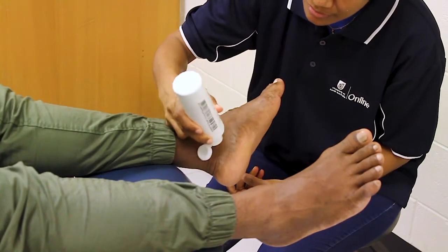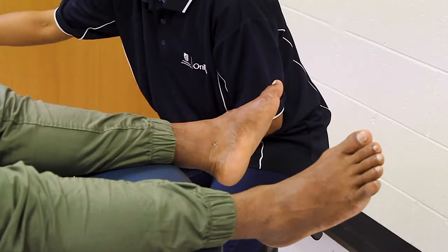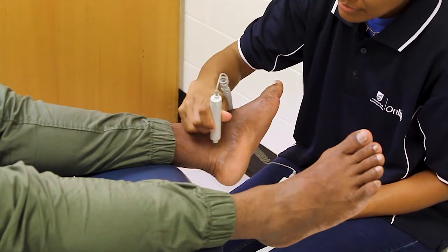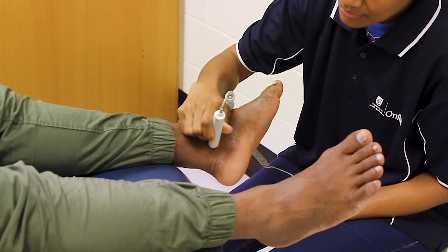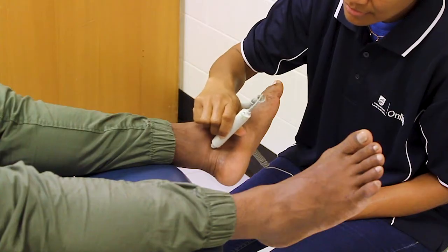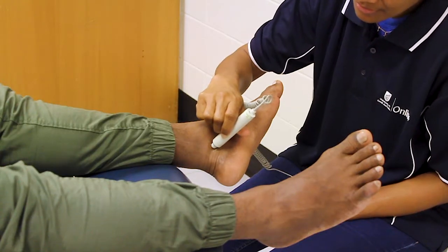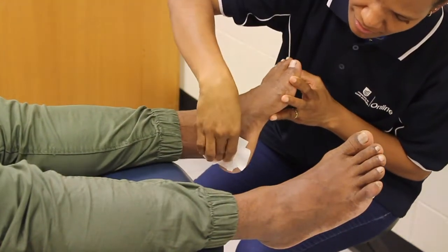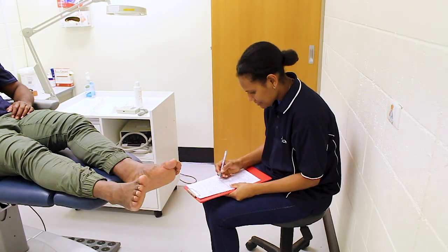Repeat these steps for the ankle pulse. Wipe away the Doppler gel using a paper towel. Record your findings to monitor the person's vascular status and assess their risk of lower limb complications.